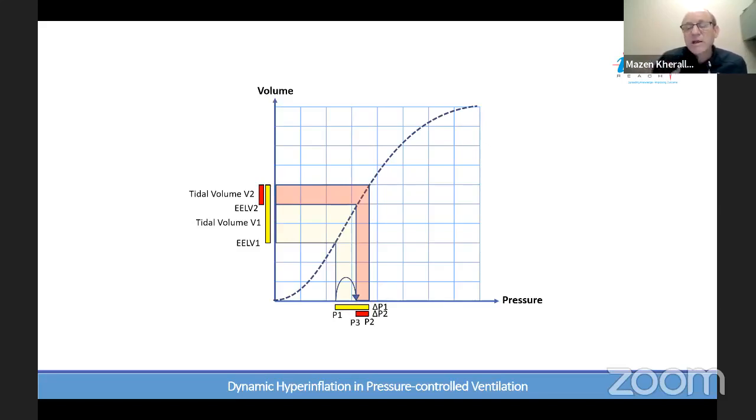So you don't want to add any more PEEP where you can actually participate in building up that pressure inside the lungs. So yes, you can decrease that PEEP to 0, the external PEEP. That's in patients who do not have spontaneous inspiratory efforts. Again, by adding external PEEP to a patient who's breathing on his own, you can eliminate the inspiratory efforts that the patient has to do.